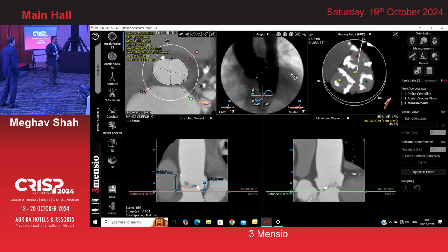If you have the software in your hand, you can look at one CT 10,000 times. It will train you better than looking at 10 CTs 10 times in a year. If you are really interested in something, you have to keep looking at it. If you keep looking at these S-curves, you will find things which have not been described yet.